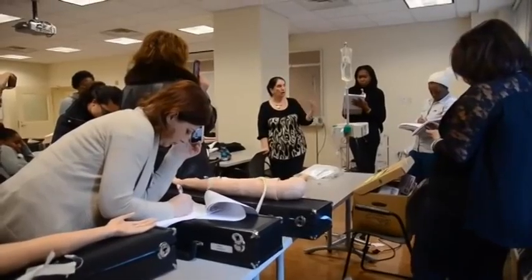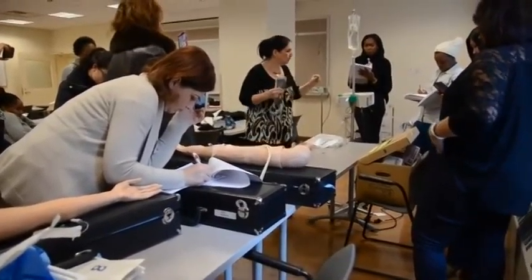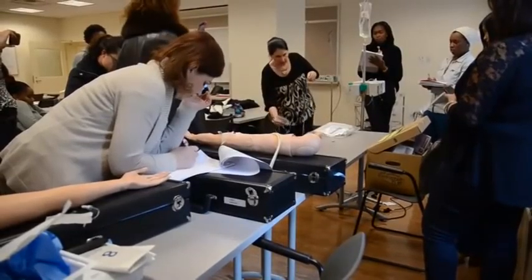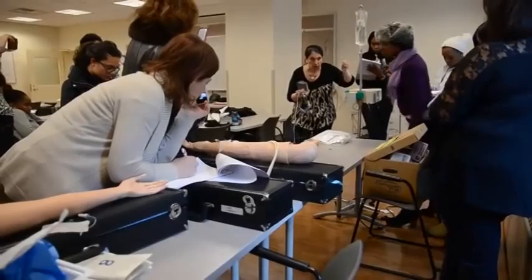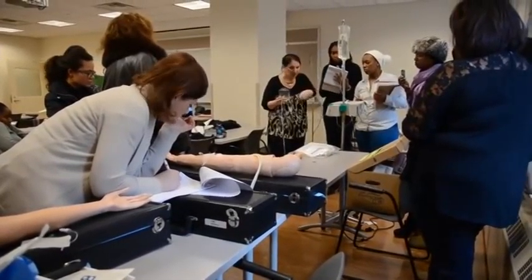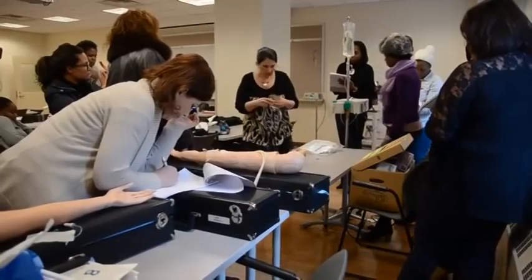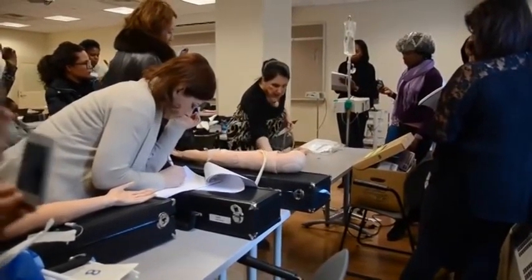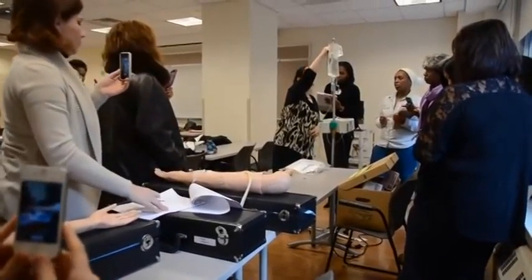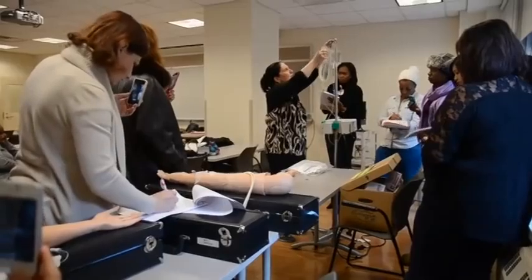We want this pump to go wherever it's going. We want to leave it alone — they need the fluid or the med that's in there. We want to give them an antibiotic, but we don't have another line. So now what do I need? I need primary tubing. I'm not going through the pump — I'm bypassing it. Secondary tubing is not going to reach there. So now I'm going to bypass the pump. I need my little blue thing and my alcohol.